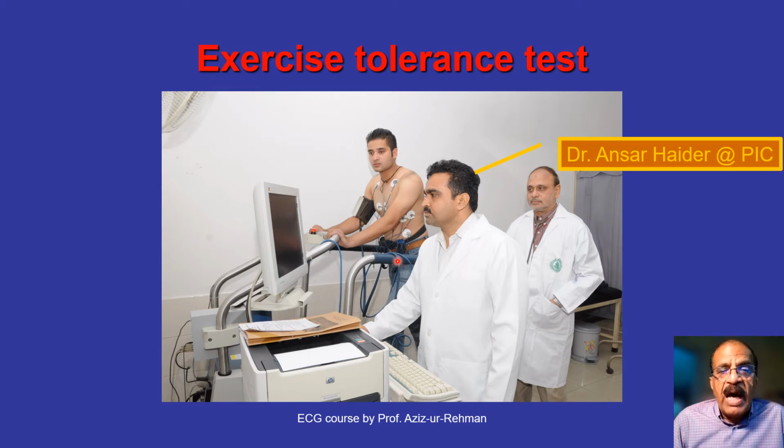This test may be great for those who are able to do exercise. There are people who are unable to do exercise because of their joint problem, because of their lung problem, or because they have never done exercise, poor physical condition. For those who can do exercise and where the history is that of exertional chest pain, this test may be great. But the exercise tolerance test does not have 100% sensitivity or specificity. It has reasonably good specificity, but it is very, very operator dependent. So I think it is not as popular as it used to be, but it can still be used in those patients as I described earlier.